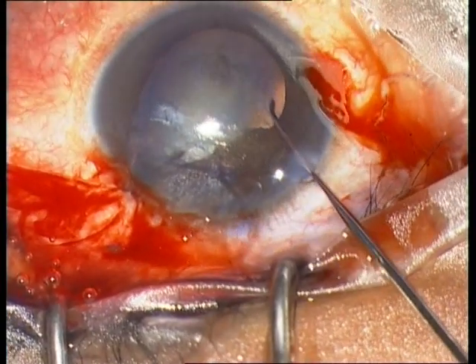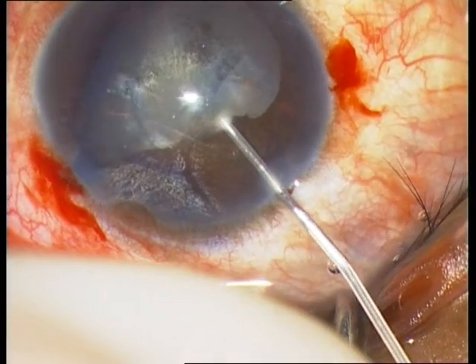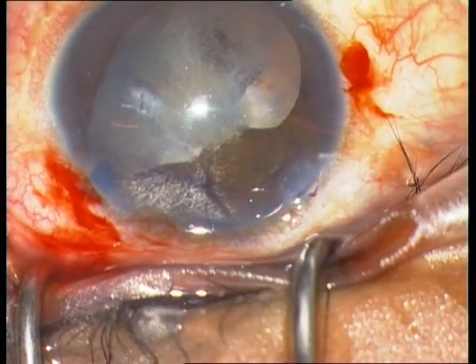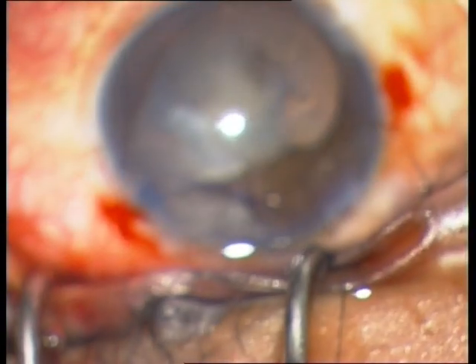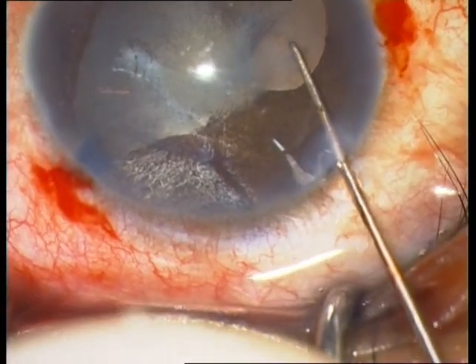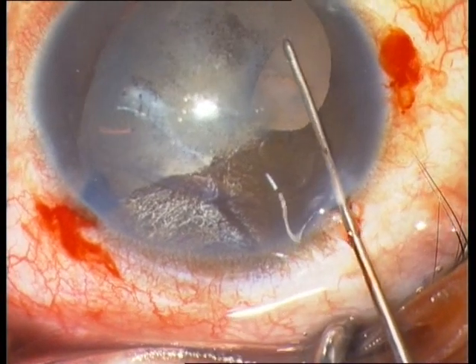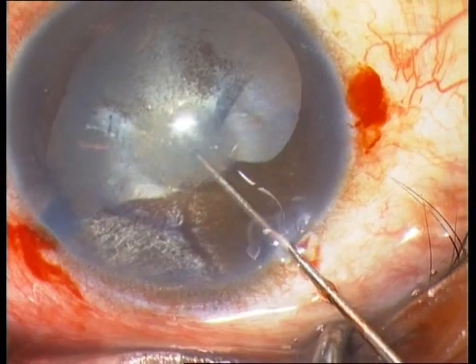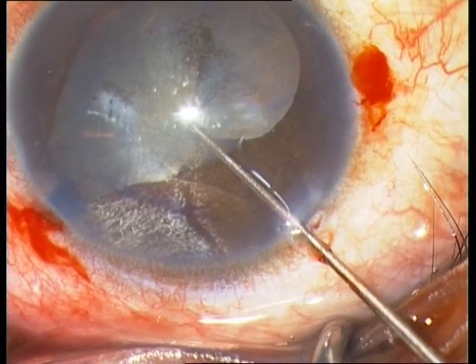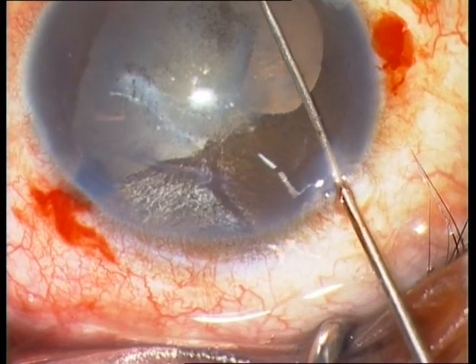Now from the other paracentesis, the same maneuver. The anterior chamber is again very shallow. I therefore switch to Helon GV, which I can highly recommend for shallow anterior chambers. Using the push-pull instrument again, I realize that the membrane stretches from the pupil at 12 o'clock to the zonules at 6 o'clock. Below the membrane, I am quite sure now, is the anterior capsule.